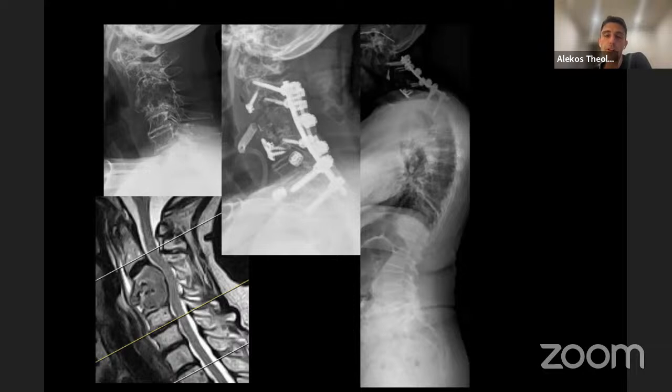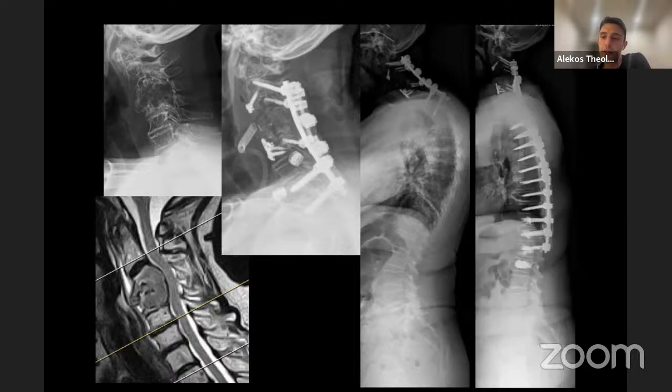You can see that she's lost her sagittal plane because of distal junctional failure. So we extended her down to T12 or so. And you can see that we tried to do our best to cement augment everything. Her sagittal plane is not great. She's still pitched forward and retroverting her pelvis. So you can tell that there's probably a lot of cantilever forces on those distal screws.